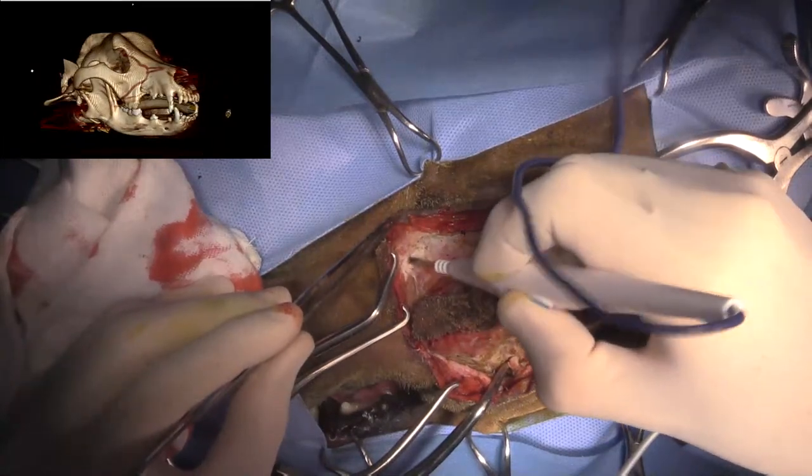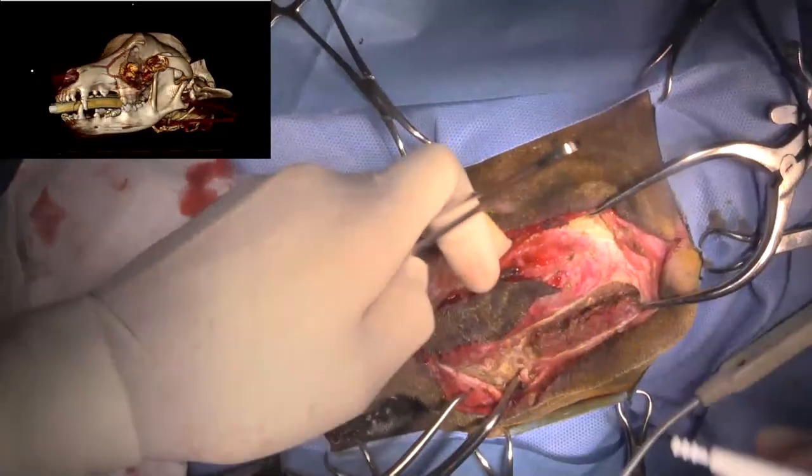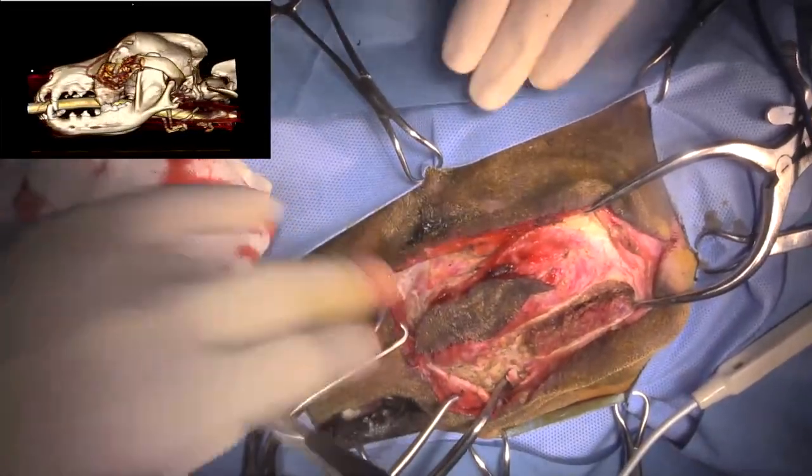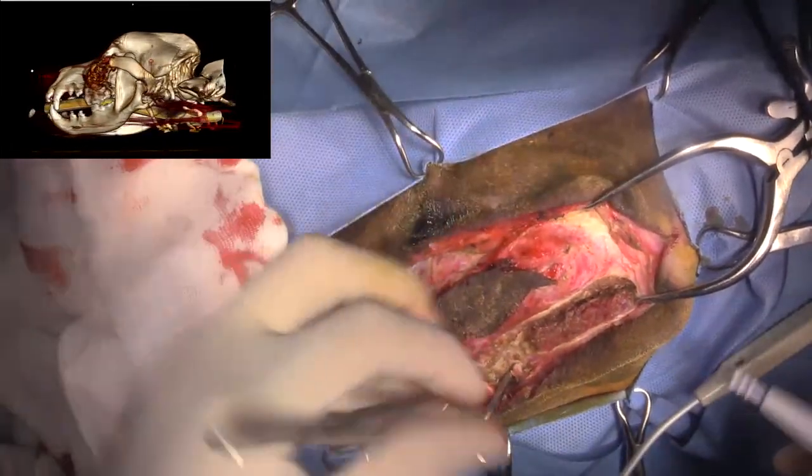So I'm coming up on top of the tumor here and getting into the medial orbit. That's the globe right there. And something pushing down. Yeah, probably a small malleable. Mm-hmm.